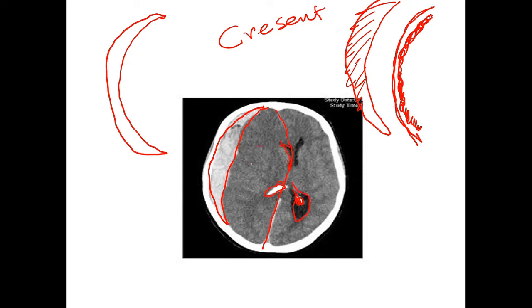There's edema around this, and also loss of the sulci and gyri of the brain. How is it treated?